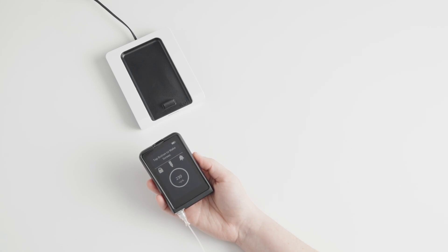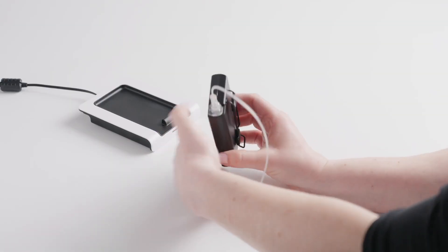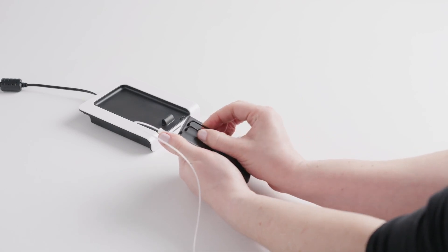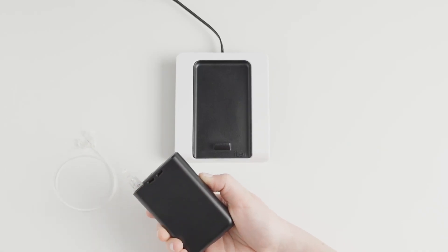Then, remove the eyelet clip. To remove the clip, slide the small black piece to the bottom of the clip, then squeeze the two sides of the top of the clip together and pull them out of the back of the eyelet.